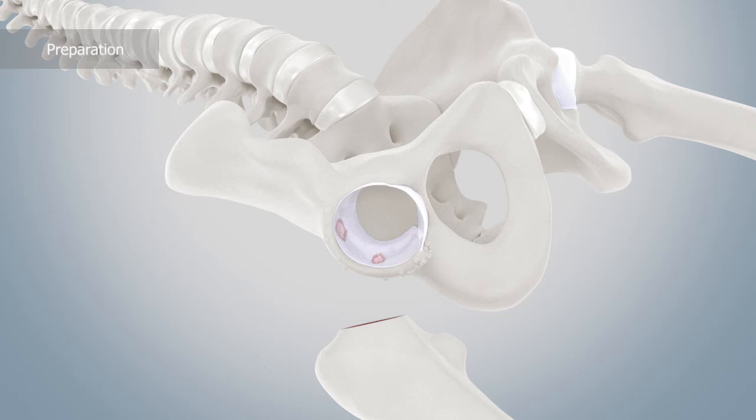To obtain an optimal view of the osseous acetabulum, various Hohmann retractors are used to hold back the soft tissues. It has proven useful to place one curved Hohmann retractor each on the ventral and on the dorsal rim of the acetabulum. In order to not damage the adjacent vascular and nerve structures, the retractors must maintain close bone contact and must not be placed too far medially into the soft tissues. Optionally, a third and fourth Hohmann retractor can be used cranially or caudally.